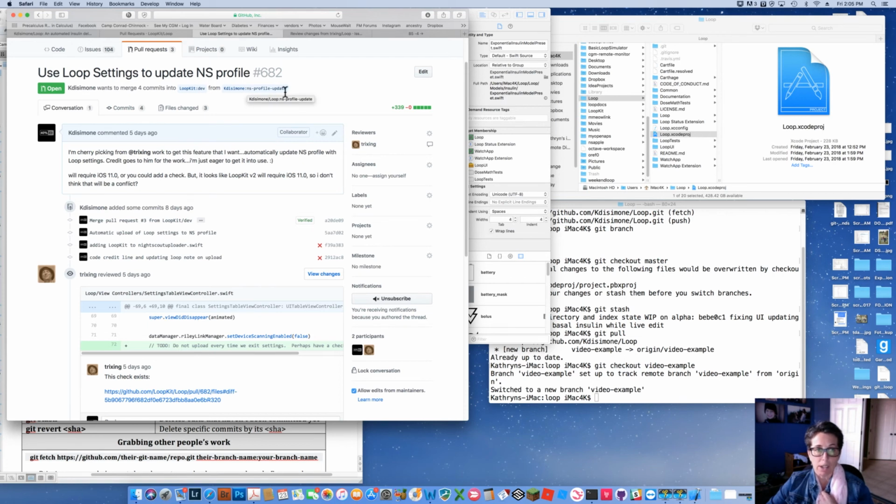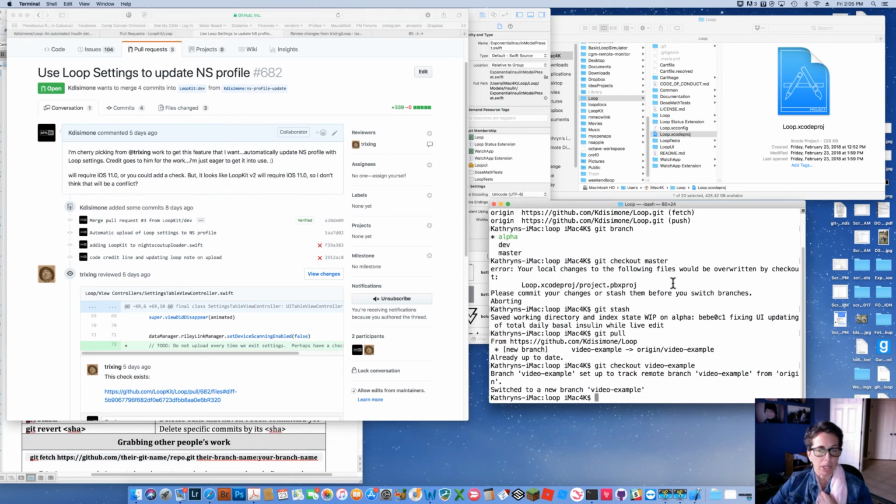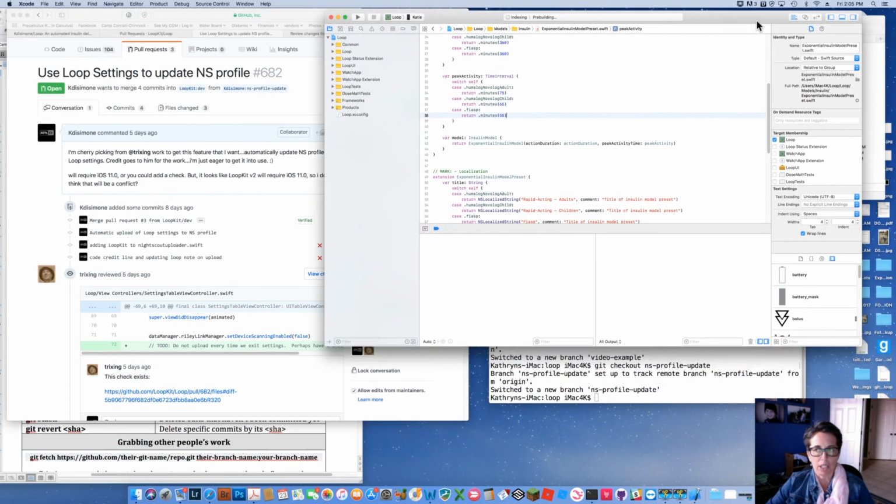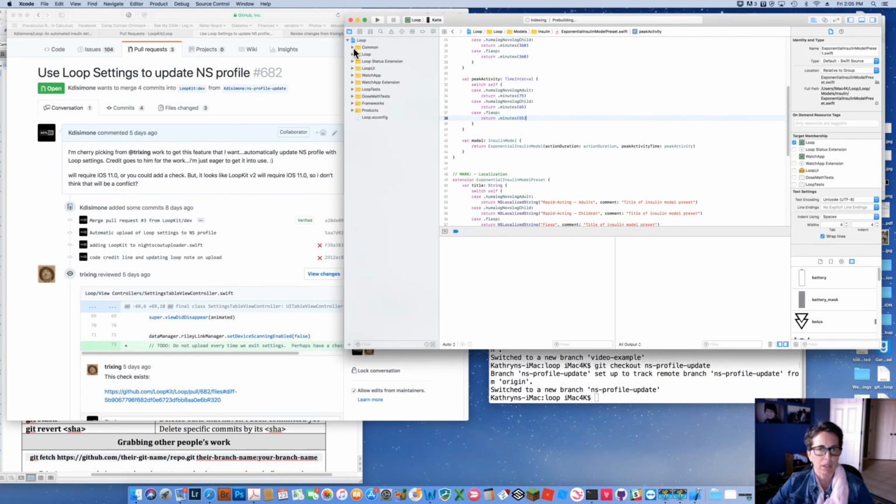I can do that one of two ways. I can go there directly, or I can do it on my terminal app here. If I'm going to do it here, I need to check out that branch, Nightscout profile update. I've now switched to there, and it's in the SettingsTableViewController. So let's go to that part. I'll move this over here. Loop.